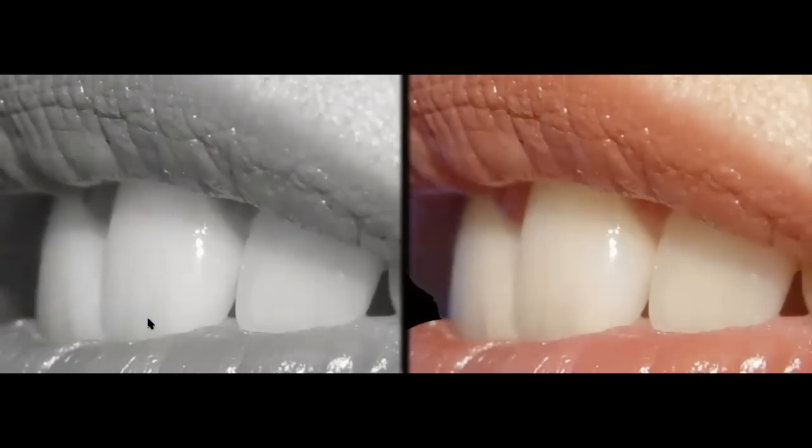This is the natural number 9, and you can see that there is no visual difference in the value of my restoration and the actual value of the natural tooth, as seen as well in this color photo on the right hand side. The value of tooth number 8 is identical to the value on tooth number 9. So we were right on the spot at the time of choosing the shade.